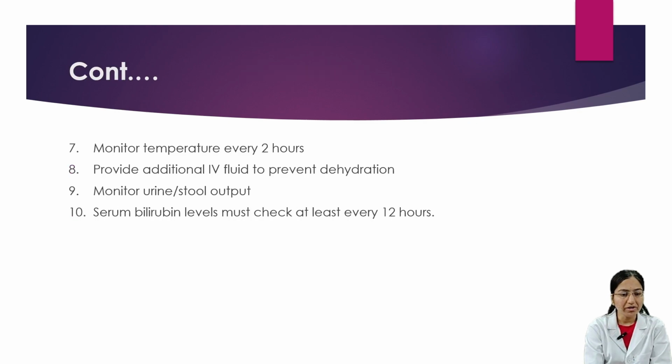Then monitor temperature every 2 hours. Provide additional IV fluids to prevent dehydration. Monitor urine and stool output. Serum bilirubin levels must be checked at least every 12 hours.